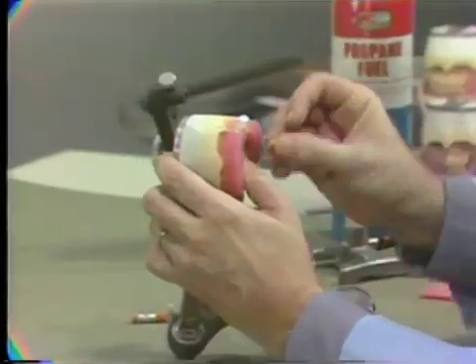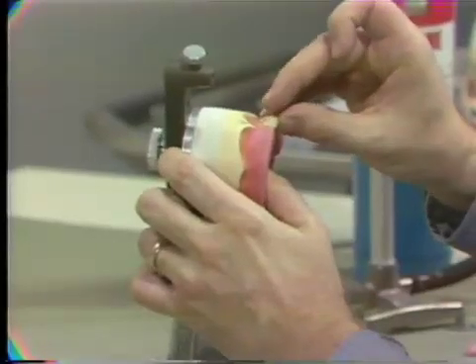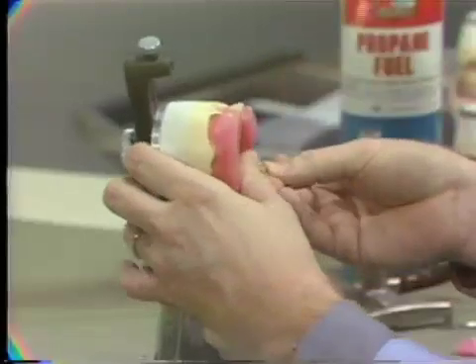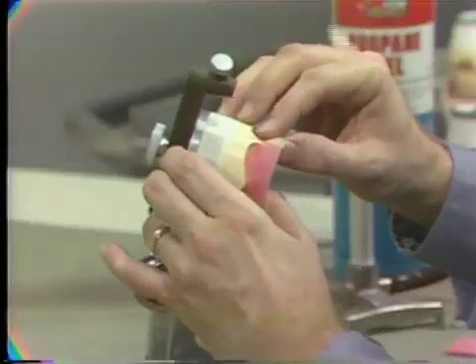So at this time we will remove the green wax from the tooth and set the lateral incisor. As I said before, there's no need to grind these teeth if they're set correctly in the setups that you have.